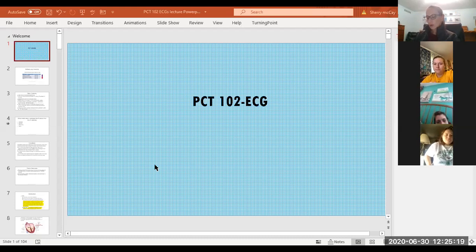How should you clean the equipment? You're going to use a soft cloth moistened with disinfectant or an alcohol-based substance, okay? There's a P wave, but no QRS. You should report this to the nurse right away. Your patient goes into asystole. What should you do first? Remember that was the dead, right? Start CPR. The speed of the paper is measured in millimeters per second.